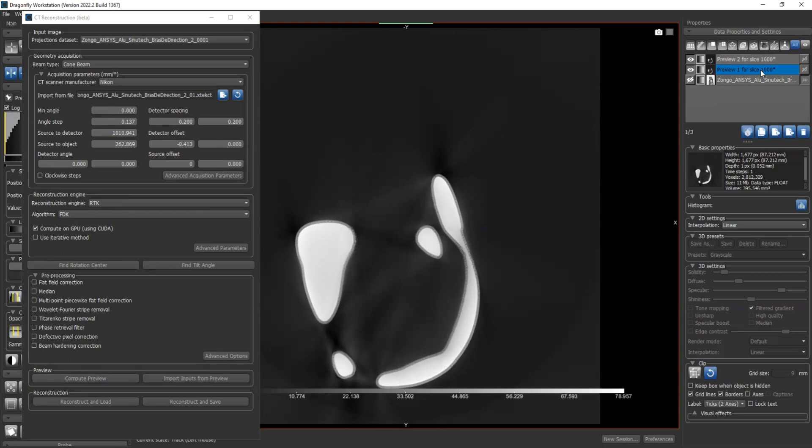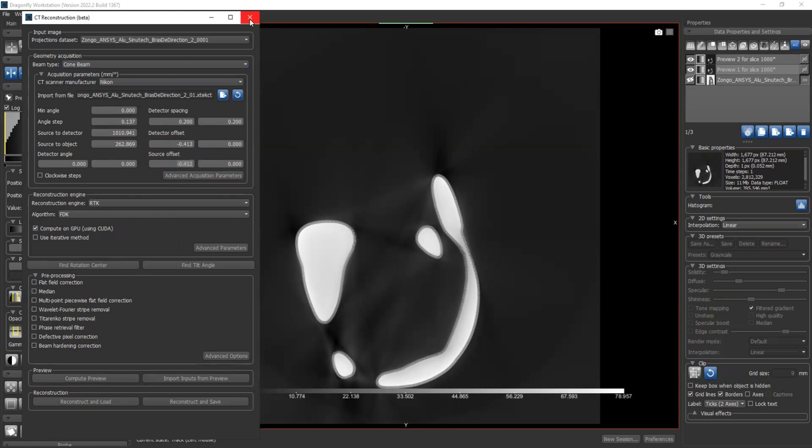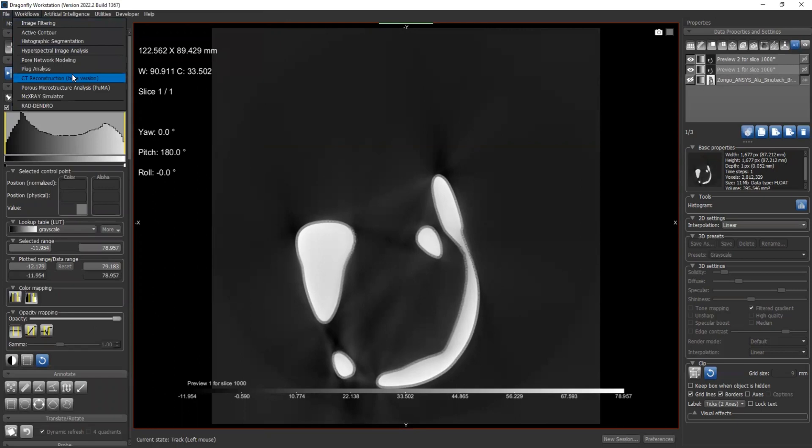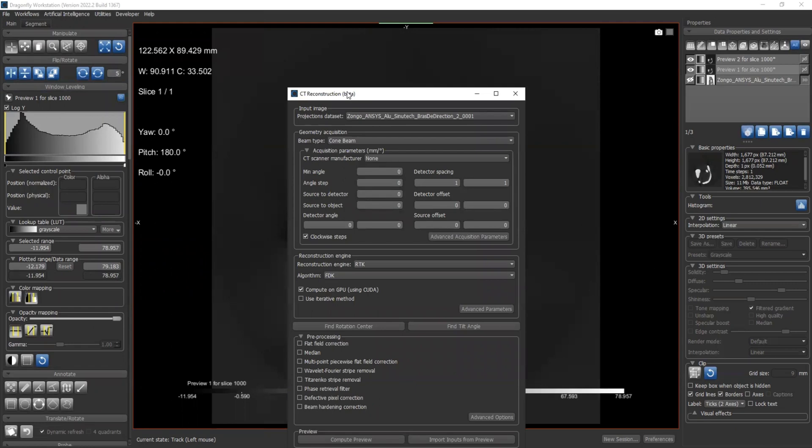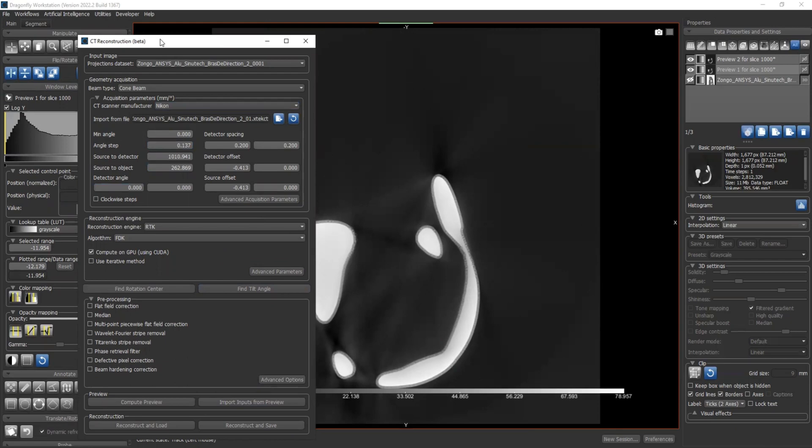I'm comparing, I feel like preview one for slice 1000 gives me a better result. I'd like to still use all the parameters from preview one, but I don't remember what values I put here before. So I can choose import inputs from preview and select preview one. Okay, now we have our source offset back. So this is going to work even if you have your CT reconstruction plugin closed and reopened. So all the parameters are gone, but I can still import, say preview one, and they're all back.